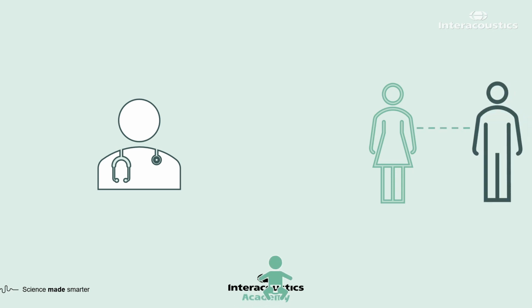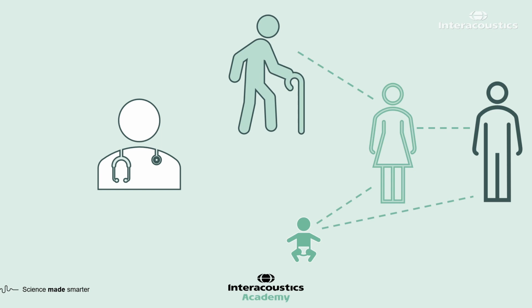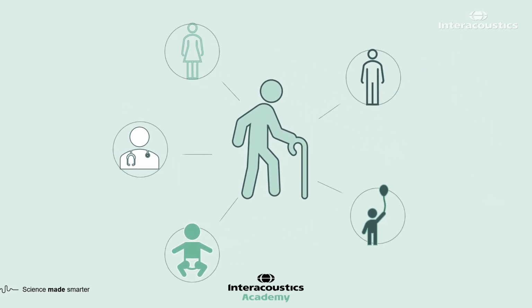The patient may be a child who relies on their parents to support their hearing aid use. We might have an elderly client who has brought their grown-up child or their carer for support, or we might have a child patient whose grandparents are heavily involved in their care. The point is, we can have a number of situations, and in all of these, it's really important that the other people in the room and the patient's life are involved.